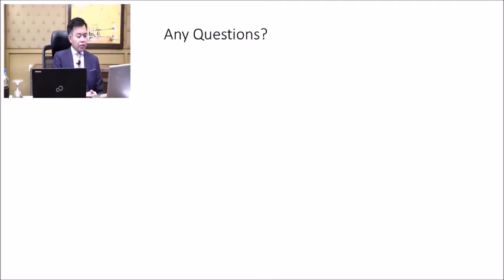The question is, how long will you wait if the patient has halos before intervention or adaptation? I would say you need to give them at least 3 to 6 months for adaptation. The most important thing to tell them is everyone gets dysphotopsia, whatever IOL you use. There are lower levels of dysphotopsia with the Symphony, and most people, as long as they know to expect it, they will be extremely tolerant of it.